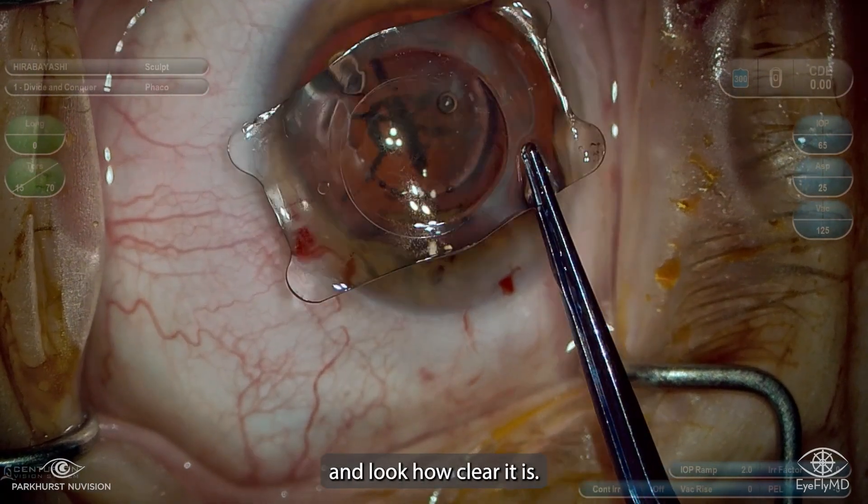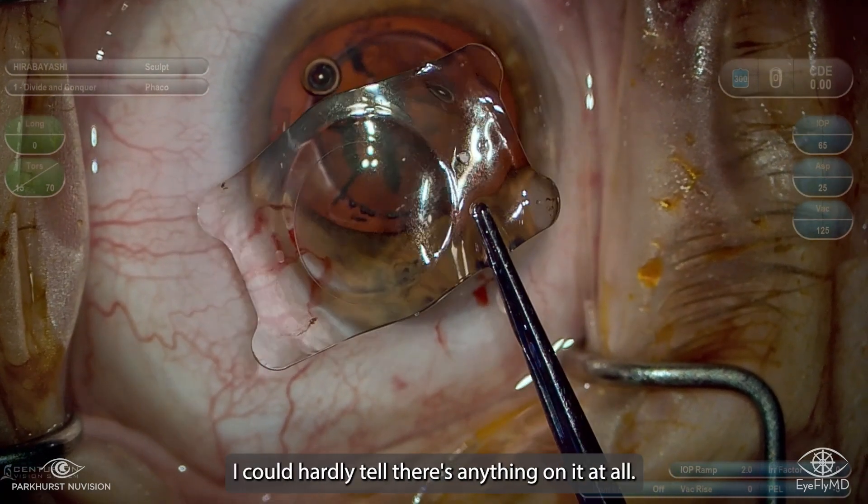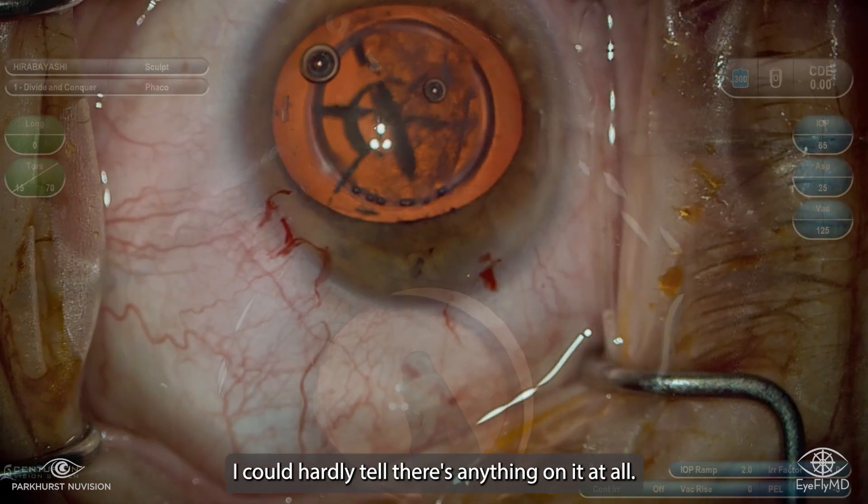The collamer material is so flexible. And look how clear it is after all those years in the eye — you can hardly tell if there's anything on it at all.